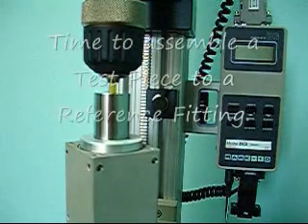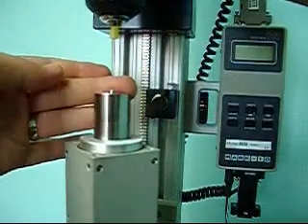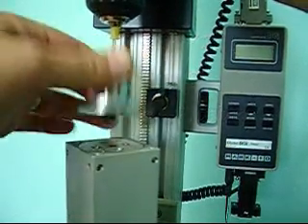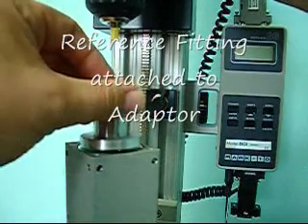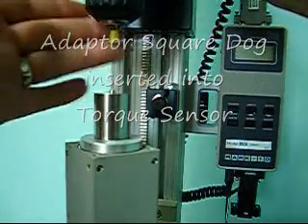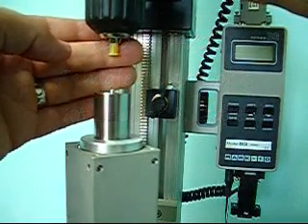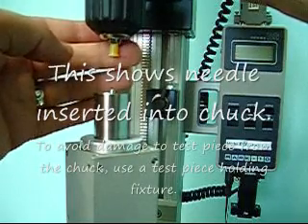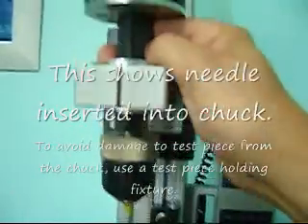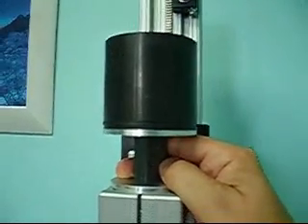We're ready. Let's run a test. Here's what we have. We have an ISO 594/2 figure 5 reference fitting, which is hooked to the adapter, which is hooked to the torque sensor. In the chuck above, I have a needle which has an ISO 594/2 lure lock female end. The chuck is fixed up there. On the weights, I have 27.5 newtons of force applied up there.